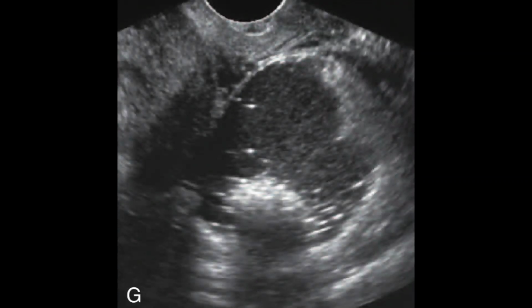The dermoid plug is formed by highly echogenic contents due to the fat. So these are fat components, and because of the fat, this is highly reflective. So this is a dermoid lesion showing two radiological patterns. The one is dermoid mesh, which appears as small tiny reflective echoes representing a reticular pattern. So the reticular pattern would be considered a dermoid mesh, and beside this there is a dermoid plug, which is in the dependent area. Because of the high fat content, it becomes echogenic and this forms a dermoid plug. So these two patterns can also be seen in the dermoid or cystic teratoma.